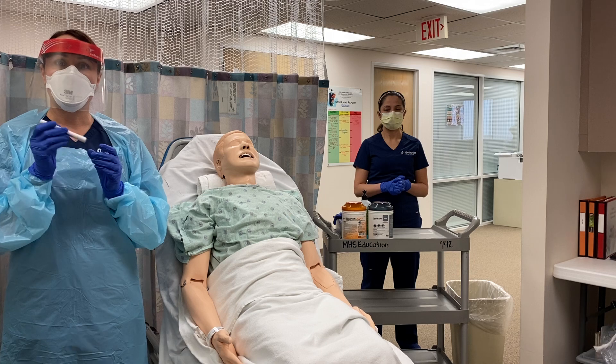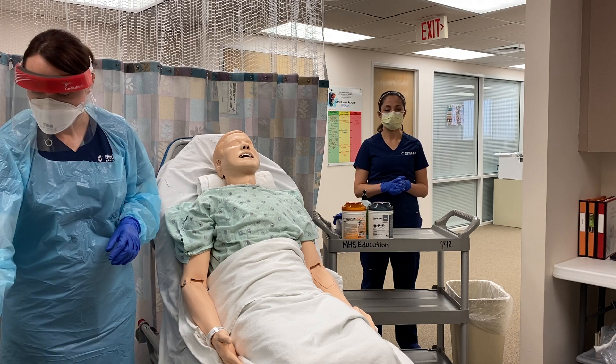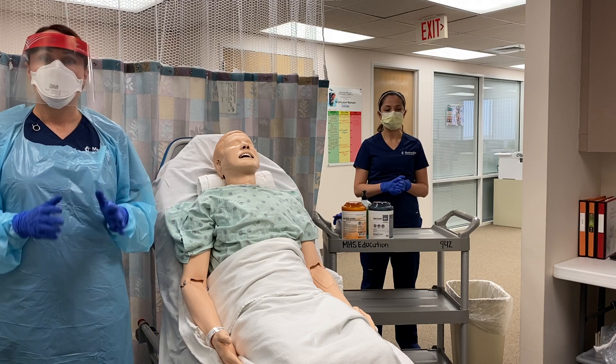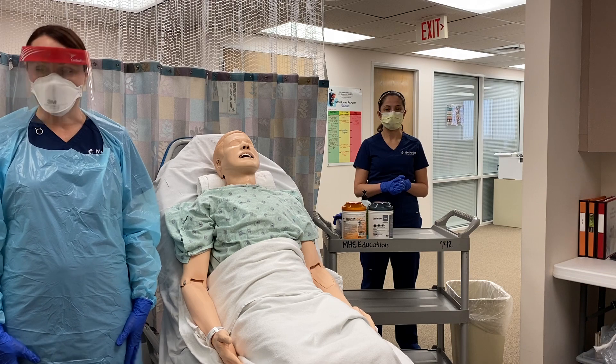You'll also want to make sure you have a light so you can inspect your patient's nares for any obstructions. Before you come into the room, make sure you've donned the appropriate PPE using the buddy system as well.